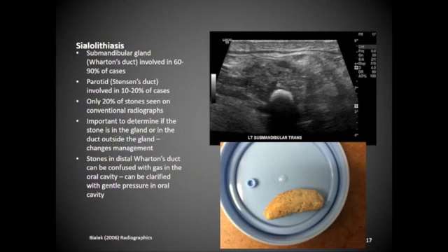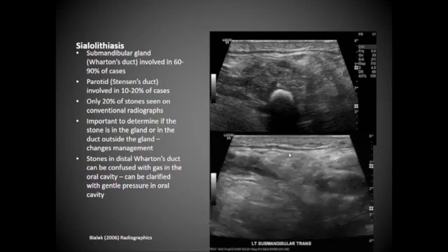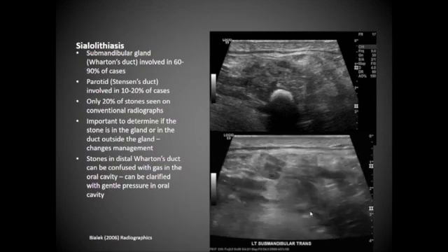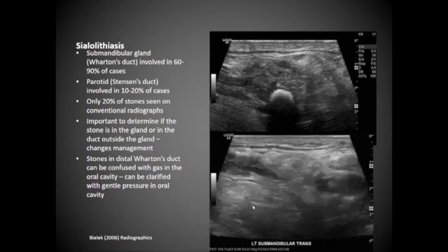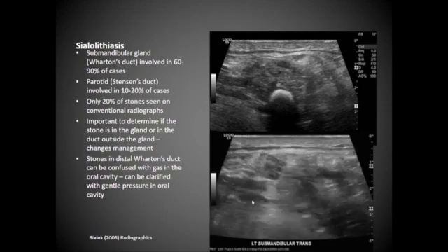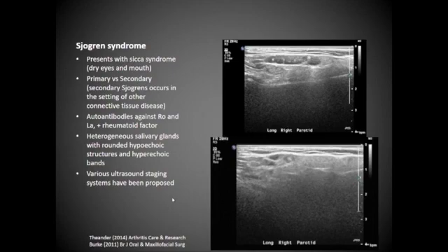The patient was extremely happy, and here's what it looked like after the stone is removed. The submandibular gland was still inflamed with some dilated ducts, but the patient actually felt better almost immediately. He was actually referred for a biopsy of the submandibular mass, which obviously didn't happen.